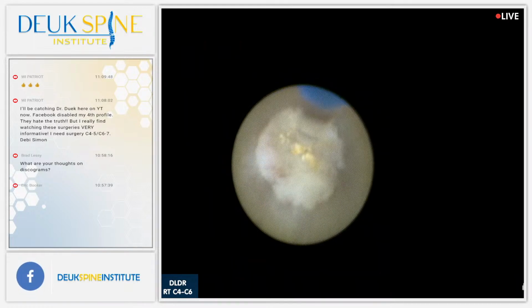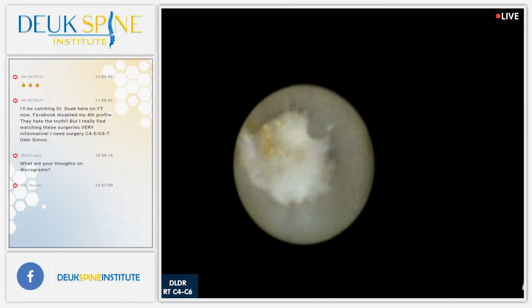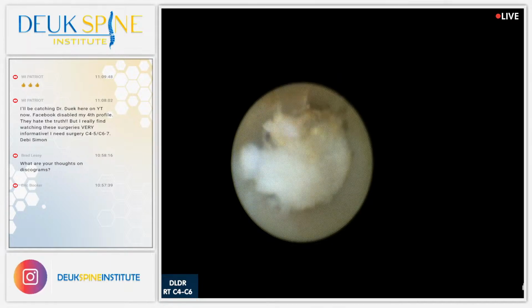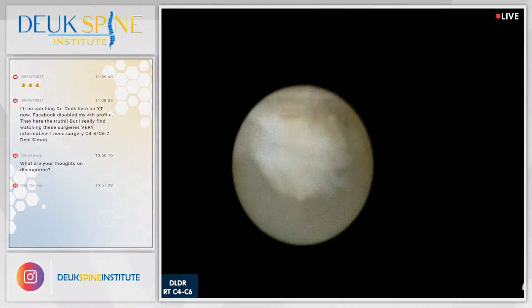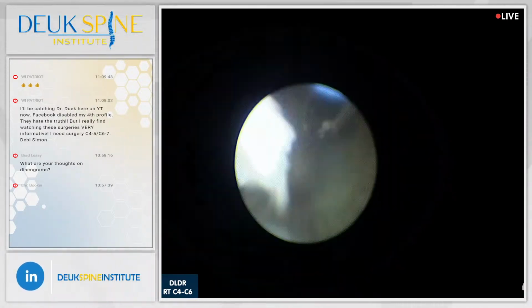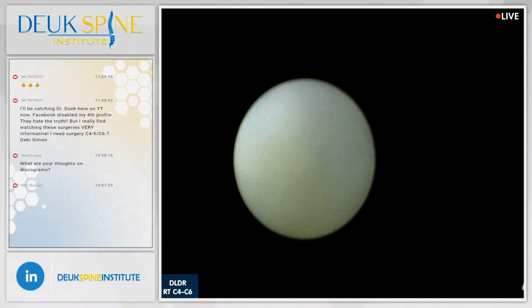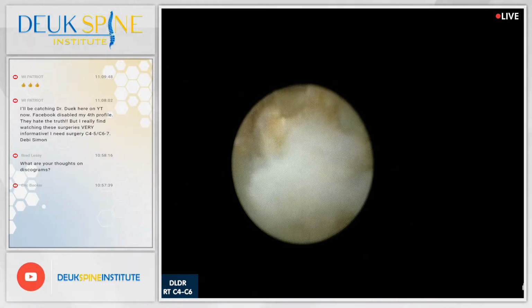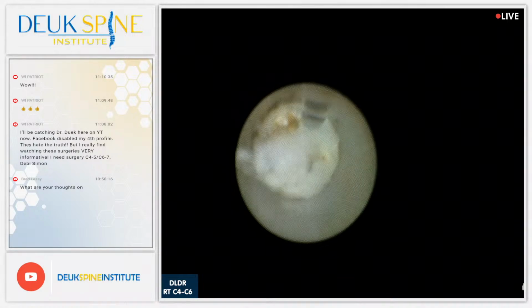You guys see it? Yes, we do. A lot of calcium. You see that? That means it's been going on for a long time. Scar tissue. Look at all the white stuff. Scar tissue. Lots and lots of it. Just as I predicted. More. All right, we're going to be done in 5 minutes. Dr. B. Yeah, I do like the fact the scope auto adjusts the light.